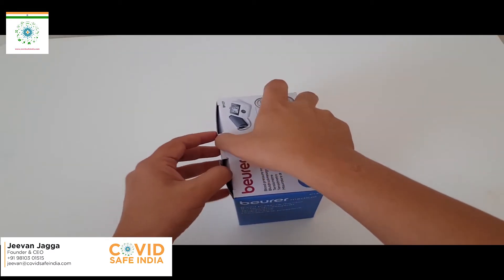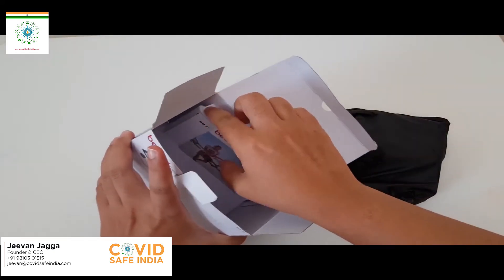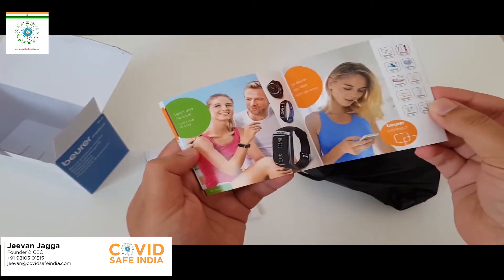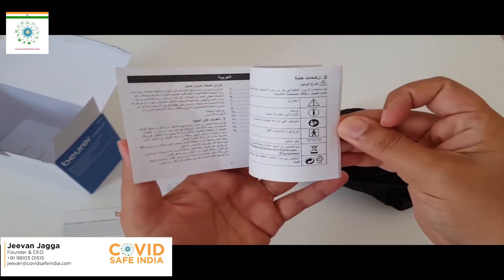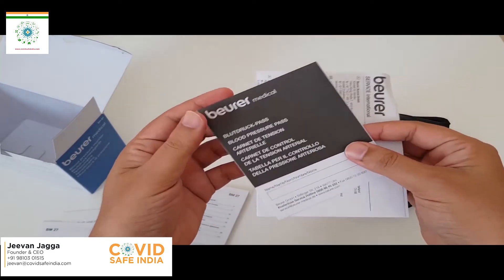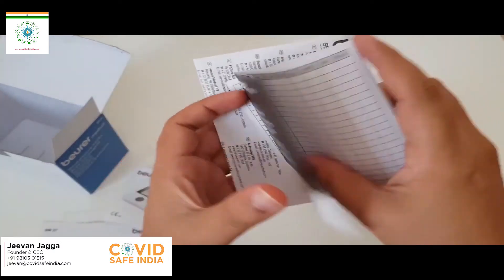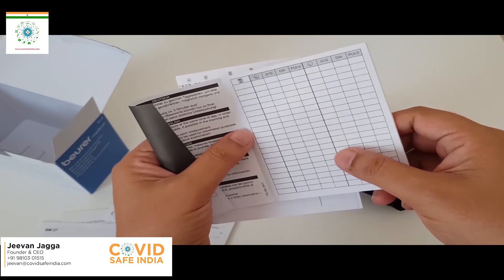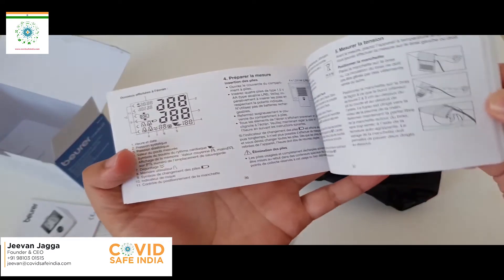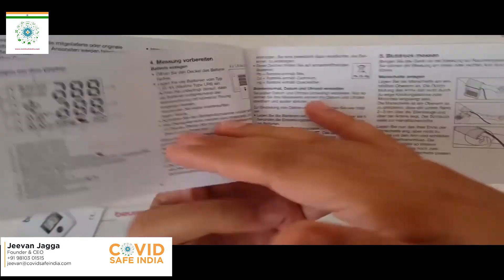Let's open the box and see what's inside. There is a sort of diary to keep your readings for a scheduled period of time as per the doctor's recommendation. And this is the main manual — I haven't used this before, so I need to see what they're saying.